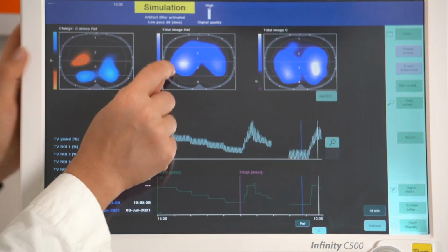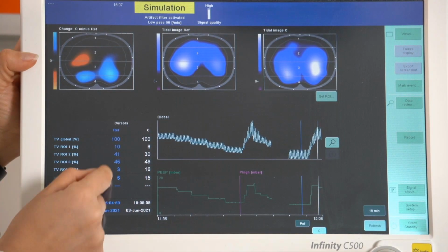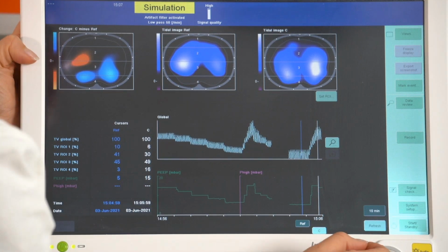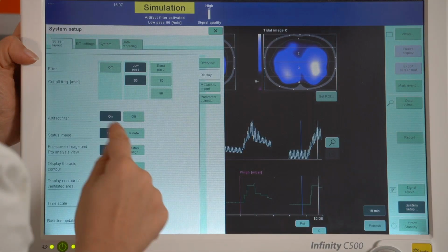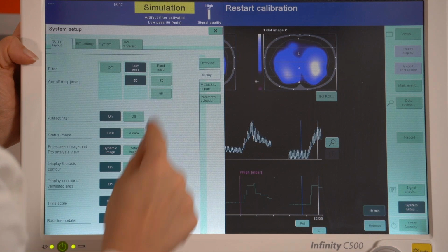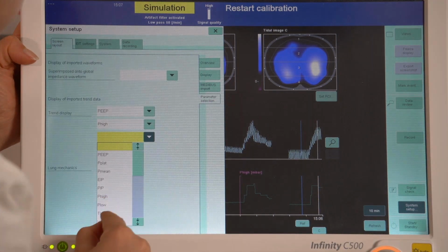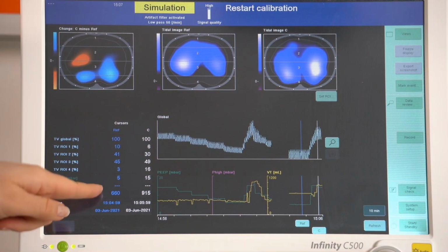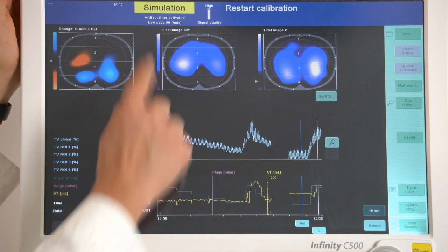There is no blue color in the region number 4. So we can see here that there's no ventilation. And if you look, we have a tidal volume of about 660 milliliters with a PEEP of 5. And we have no ventilation.